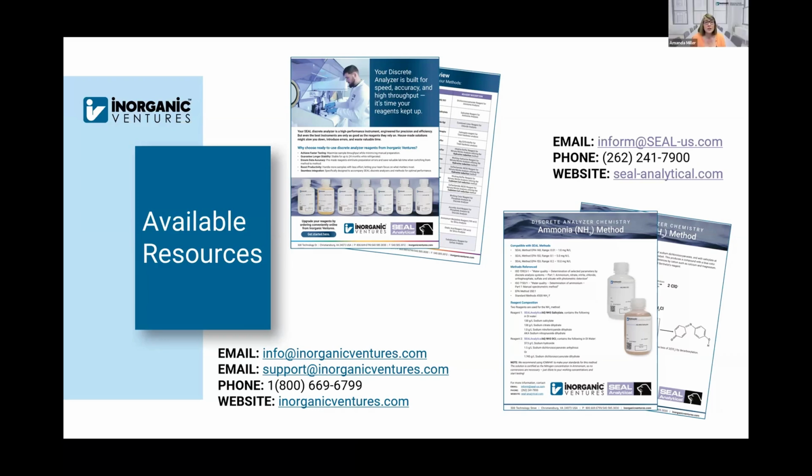Okay, one more question. Chloride combined color reagent needs to be filtered prior to use if it sits around for a while. Does the pre-made need to be filtered also? We haven't seen issues with it having any sort of particulate in there. If you see it in there, I would recommend filtering it, but like I said, we haven't had any issues. We filter them before, while we're packaging it, so it should be good to go.